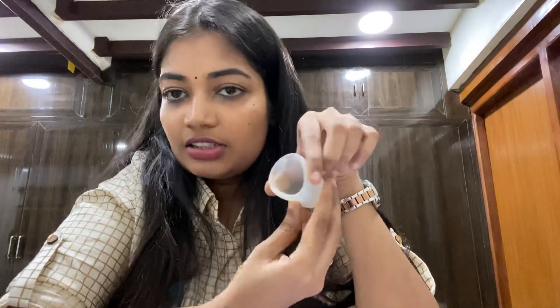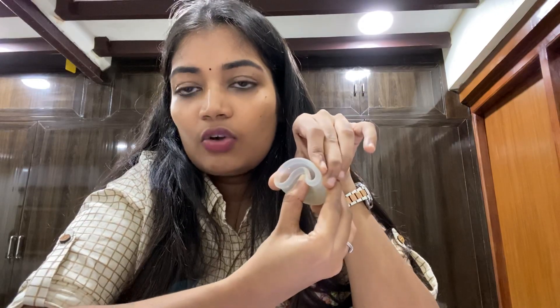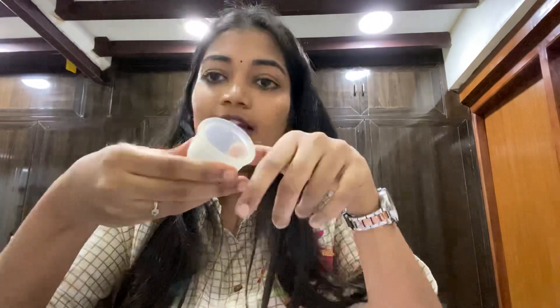After removing, fold the cup into a C shape, empty the contents, and wash it thoroughly. You can boil it again to sterilize it according to the guidelines, and then reuse it.